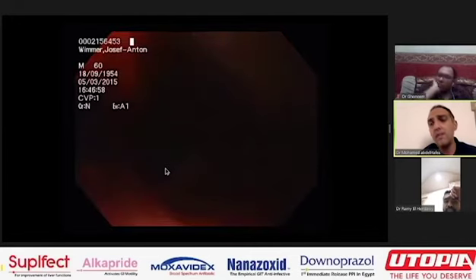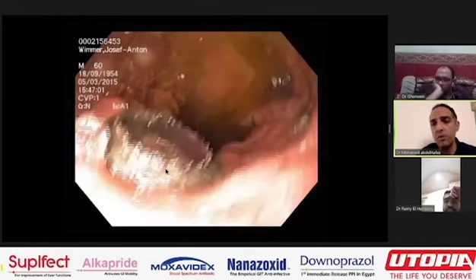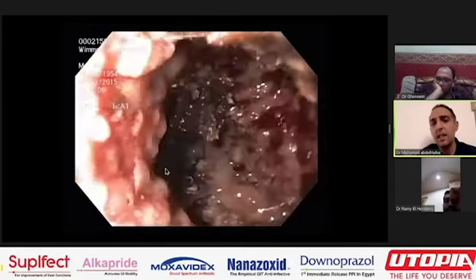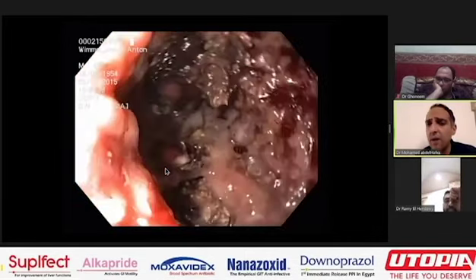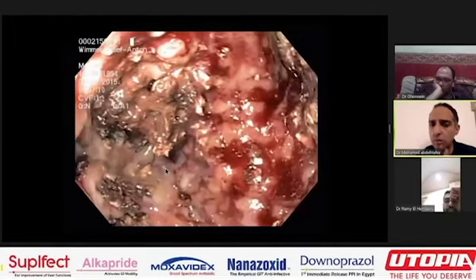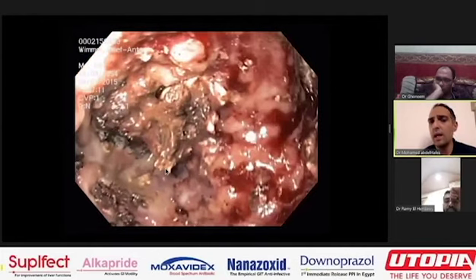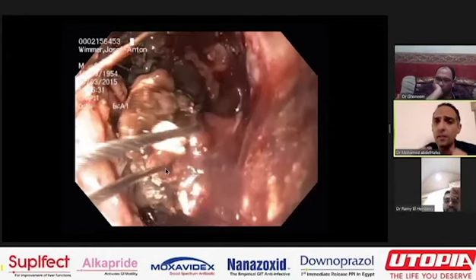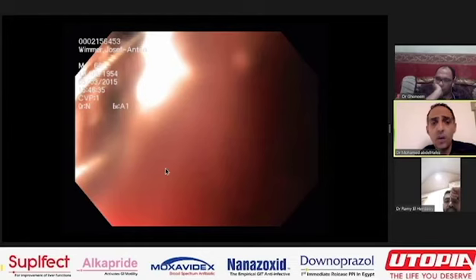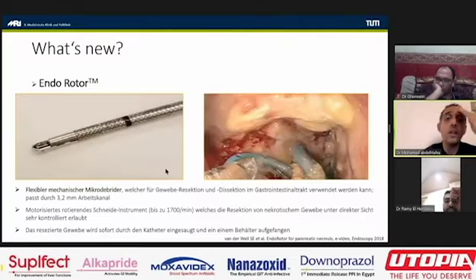With pigtails, every time you will start a new session, you have to remove the pigtails, do dilatation sometimes to come inside. At the end, you have to put pigtails. Here it is quick. I myself, I'm still a big fan for necrosectomy. I'm still old school fan. I like to work mostly with pigtails because I feel with the axis that I'm a little bit restricted. I can't move with my endoscope to achieve full necrosectomy. What is new? We have this something called endorotor. Sorry, the technical description is in German.